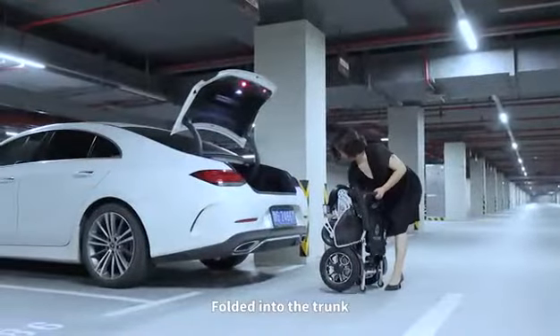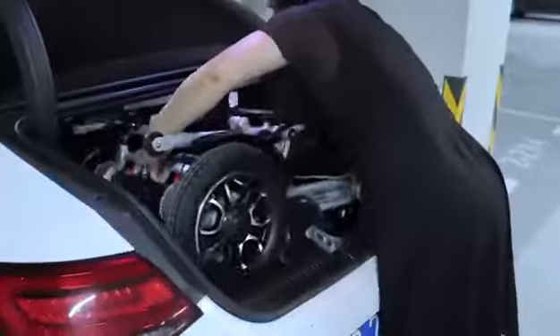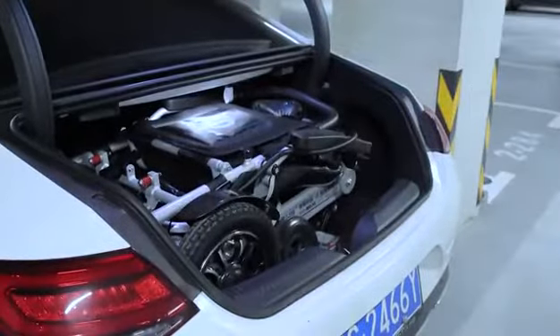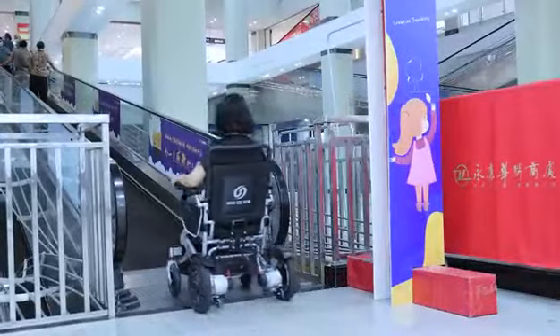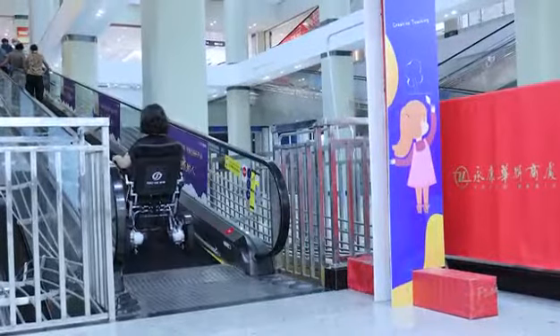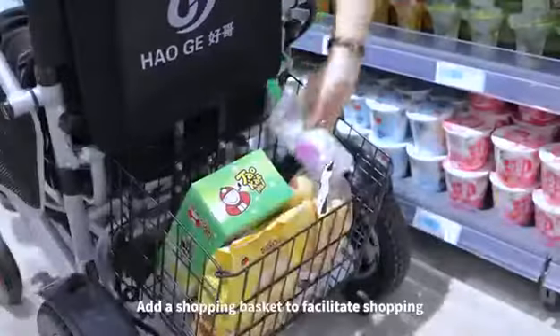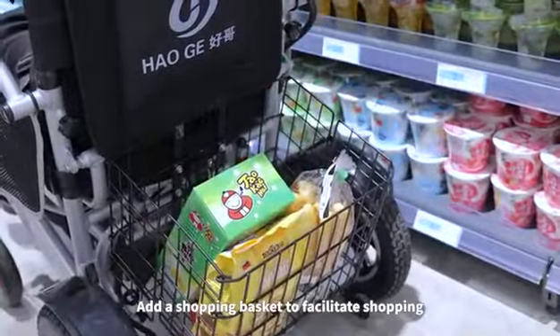Compact enough to fold into the trunk for easy transport. You can also add a shopping basket to facilitate shopping.